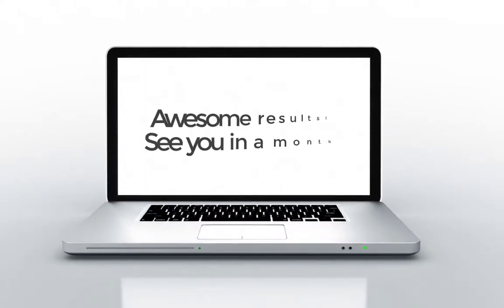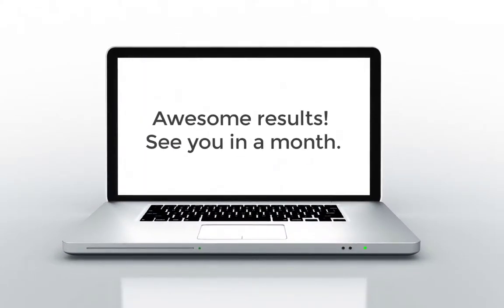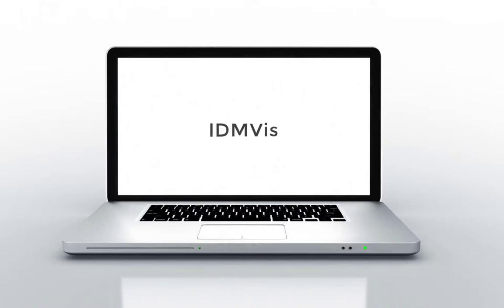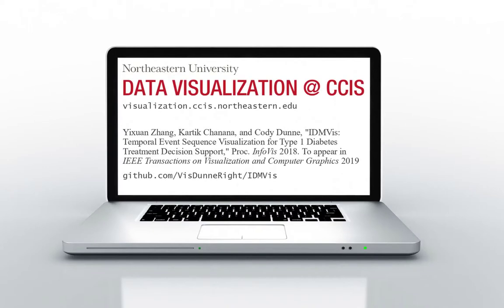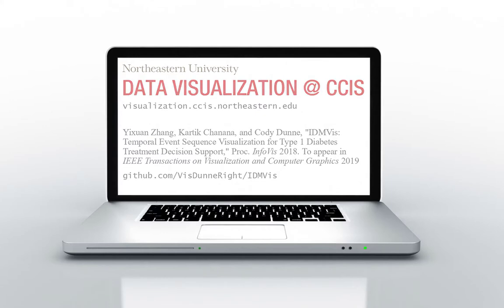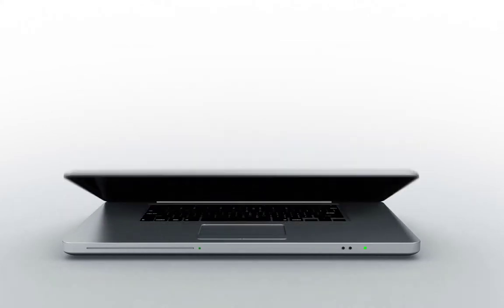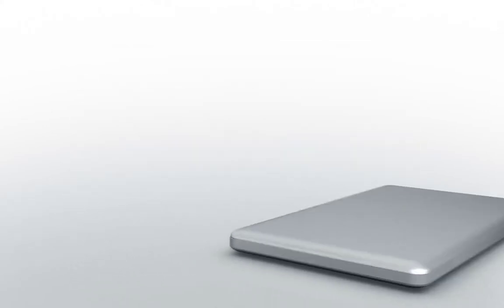These are awesome results. Let's meet again in one month. This was IDMVIZ, Intensive Type 1 Diabetes Management Visualization for Clinicians. Bye-bye!